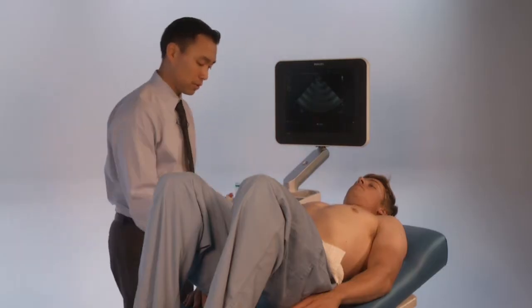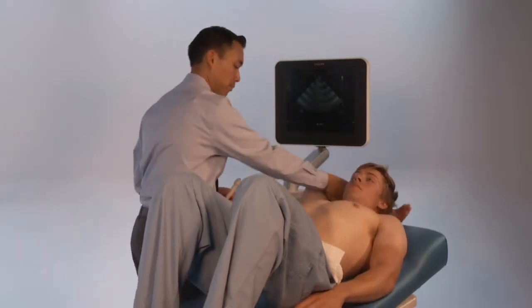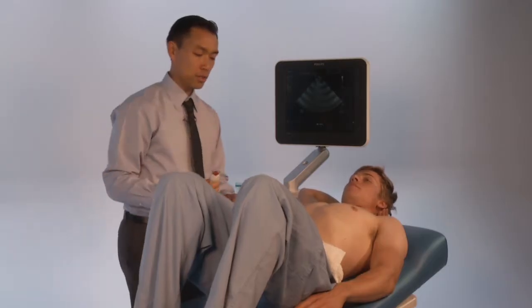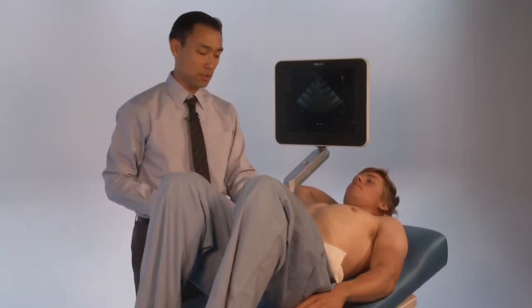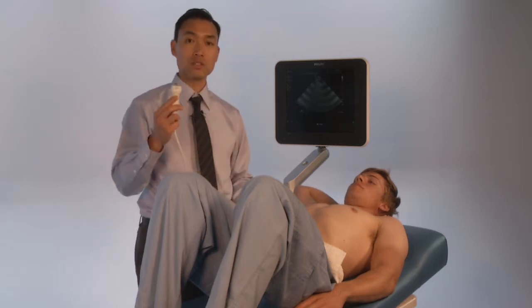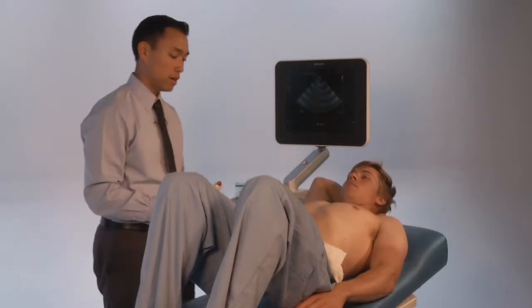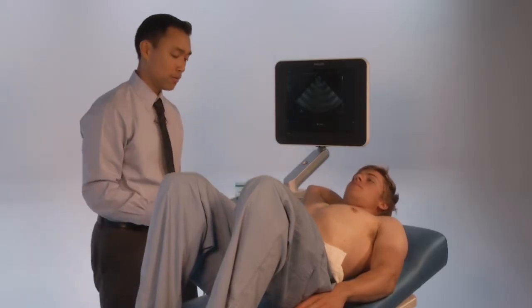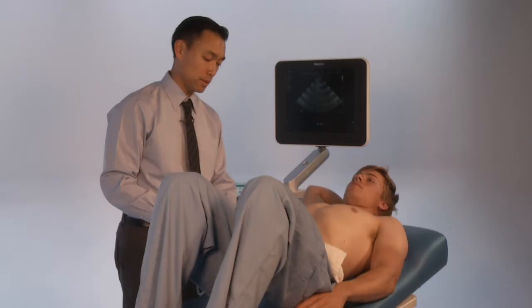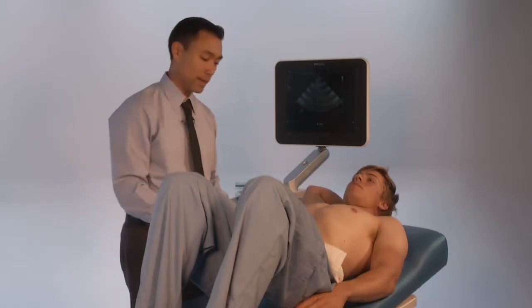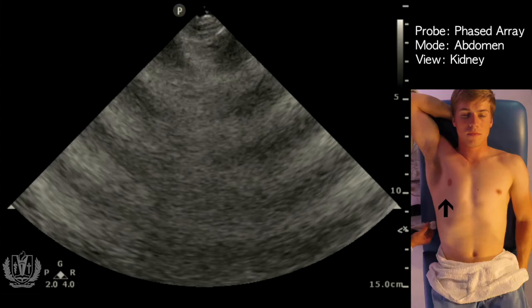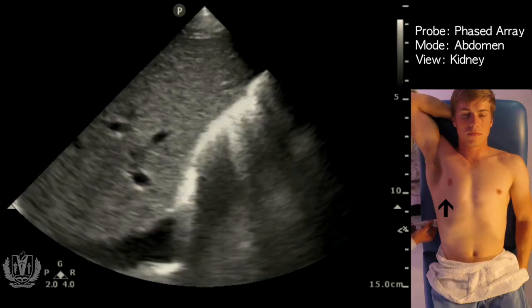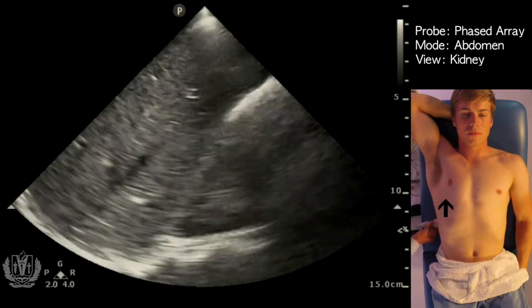We're going to have the patient supine with their arm up and legs bent to relax the abdominal muscles. You're going to use a phased array transducer on abdominal setting with the indicator up towards the patient's head for kidney assessment. The first kidney we're going to assess is the right kidney, at the mid-axillary line, about the eighth to tenth intercostal space.